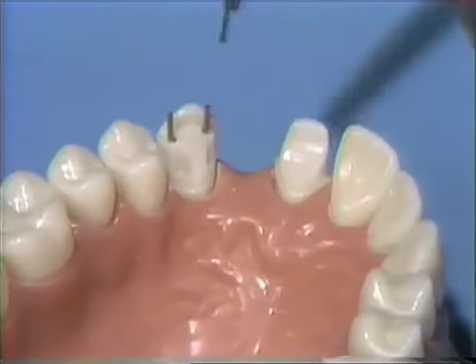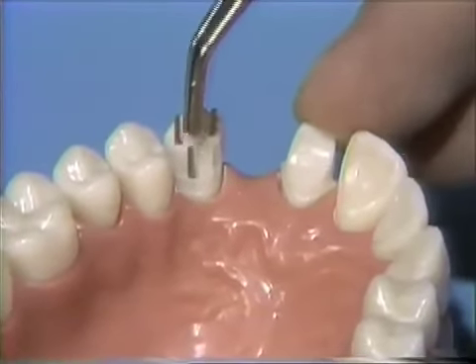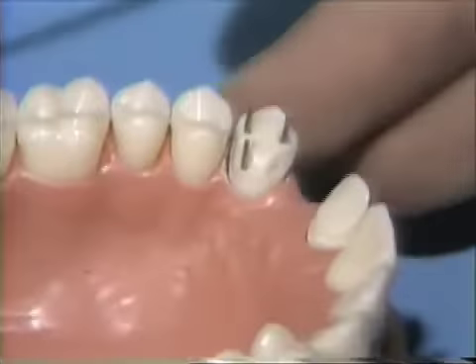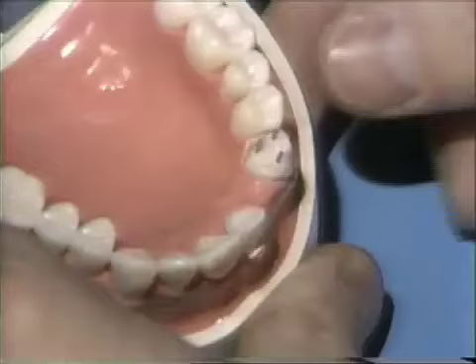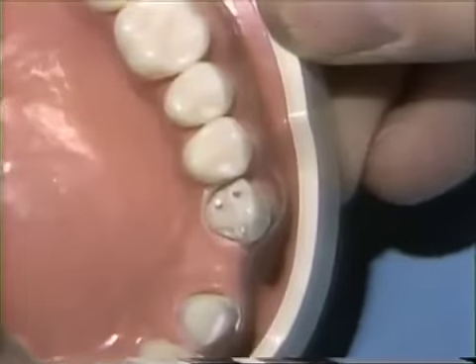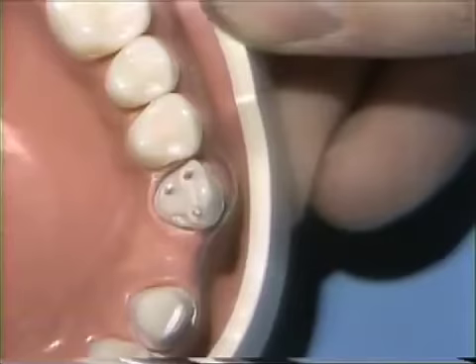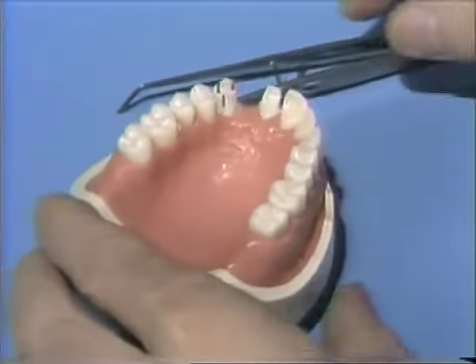We have drilled two of our pinholes and you can see the two impression pins. We're going to place the third impression pin down in its pinhole and check again to make sure they all line up. We can rotate this, checking the line of draw from all different angles. We should also be able to sight directly down the pinholes and only see the round end on the head of the pin. If we start to see the side, we know that the pins do not line up exactly in the preparation, nor do they line up with the porcelain fused to metal. At this point, we are ready to take our impression.